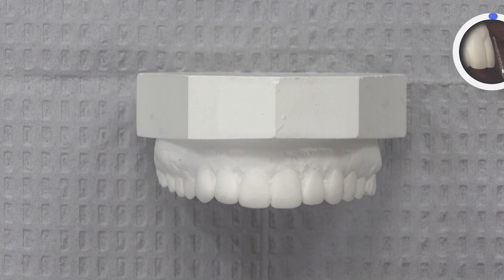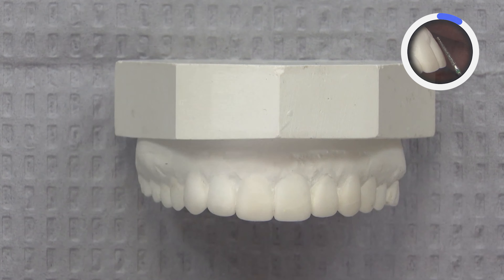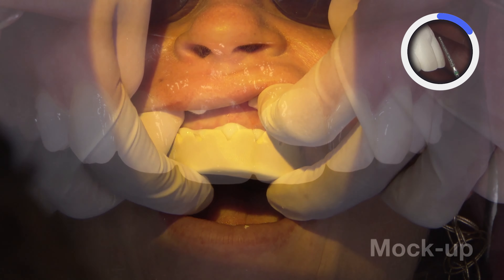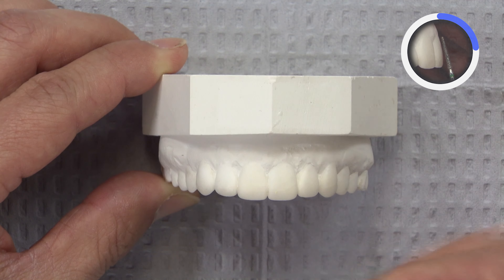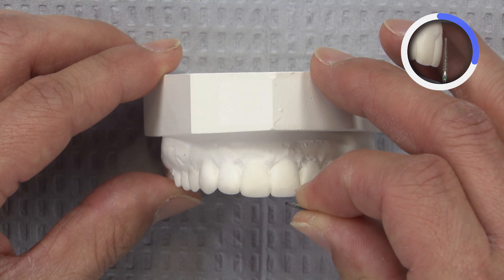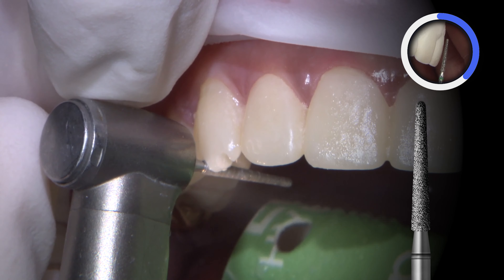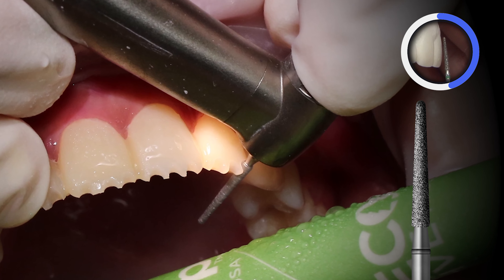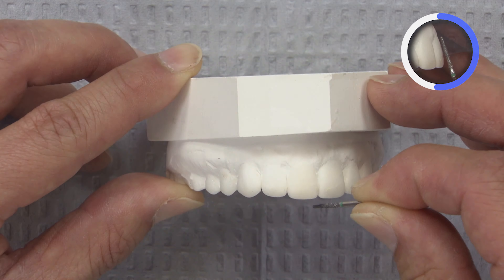I wanted to review the prep sequence I went through for this case. Based off the diagnostic wax-up and the putty matrix, we create a mock-up that goes right over the patient's existing dentition. Since the mock-up guides the preparation, we prepare right through it on the patient. I first create three depth cuts using an 850-014 burr — three depth cuts on all of the incisal edges — using more of the body of the burr, which is about 1.4 millimeters in diameter.